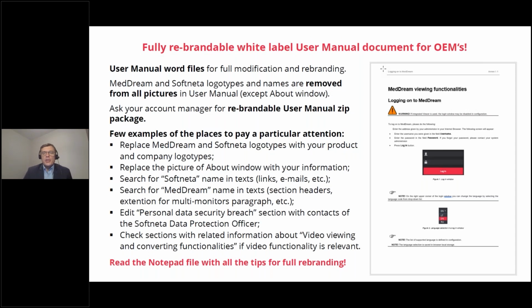Another significant change which will also come in the next release is our rebranding options. As you know, the new regulations of the EU and USA more and more place new demands on rebranding. So this change will be continuous. I really recommend you read our manuals about the possibility of how to rebrand. In this manual we also reflect all changes which are coming with the new MDR regulations.